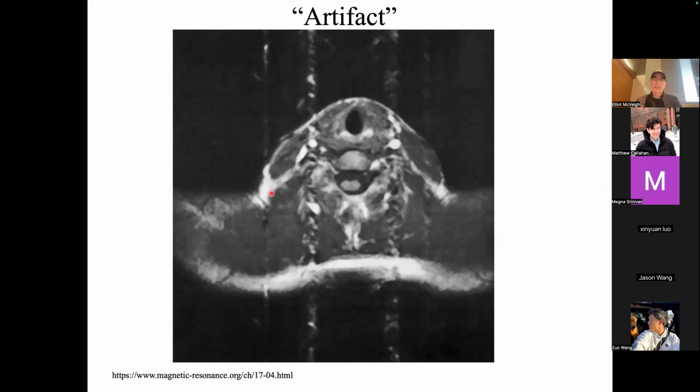So this is somebody's image at, as their shoulders turn into their neck. Okay, so there's a bit of the top of their shoulder here. This is the trachea. The spine here. These are the carotid vessels coming up the side of the neck. They're very large vessels. They feed the brain blood, and they come off the top of the aorta and come up here. They also have highly pulsatile flow. So the velocity of the blood in here is actually pretty high.